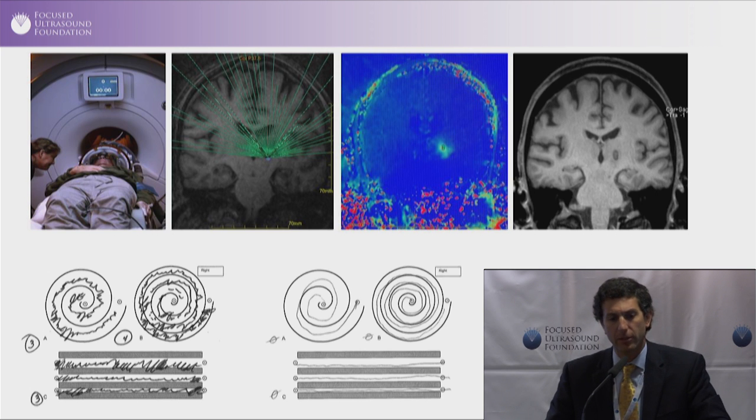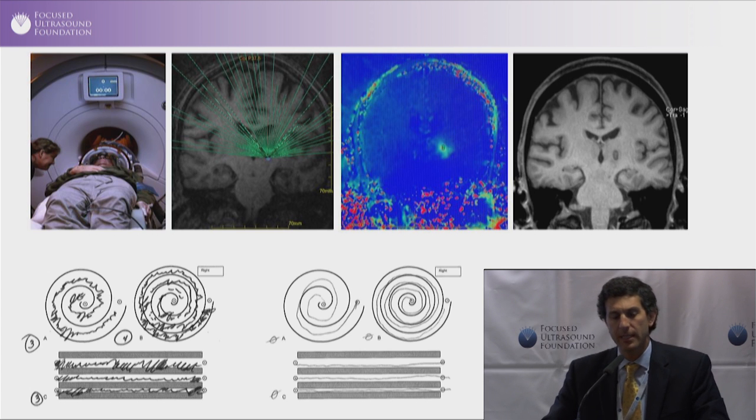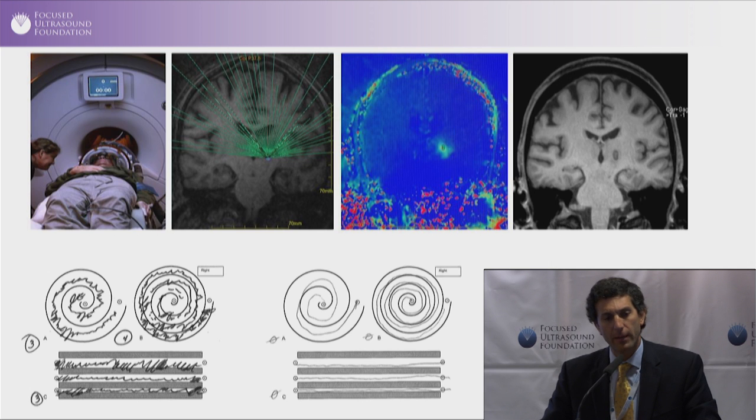In the upper panel on the left, you can see that the focused ultrasound transducer is shaped like a helmet. It's MRI compatible, so the patient can be placed into the transducer, and then the whole treatment takes place within the MR. There are a lot of advantages to this. One of the primary advantages is the ability to monitor the treatment with the MRI. MRI is capable of detecting temperature changes in the brain to within 1 degree Celsius. So we're able to monitor very carefully the treatment while it's being delivered. There are very few surgical procedures where we're able to actually watch a treatment that's going on deep inside of the body. So I think that's a key feature of this technology.